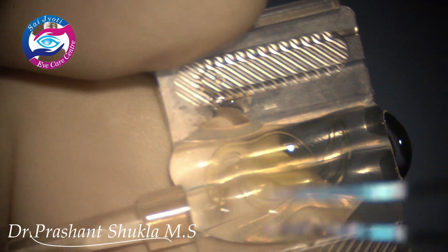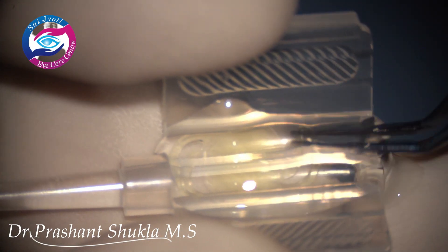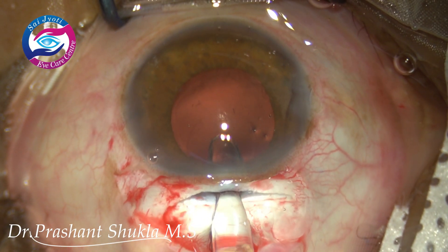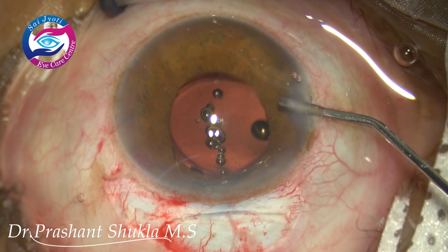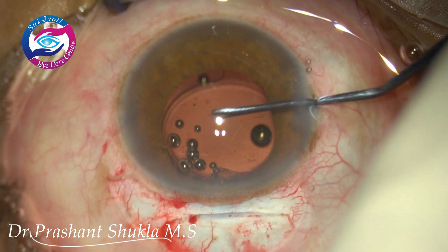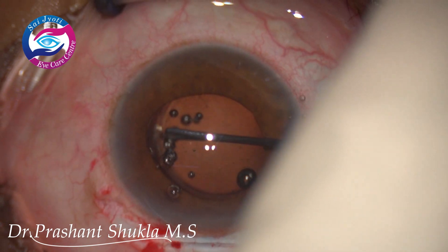Now this is how we load the intraocular lens. This is a hydrophilic foldable aspheric lens. It has been injected through a butterfly cartridge. Slowly, the lens is injected while pulling up the anterior lip of the wound — not pressing it — and directed into the capsular bag. Some viscoelastic is instilled and now I am dialling the other haptic into the bag using a Y-shaped instrument. The same Y-shaped instrument is used to retract the iris to confirm that both haptics are in the capsular bag.